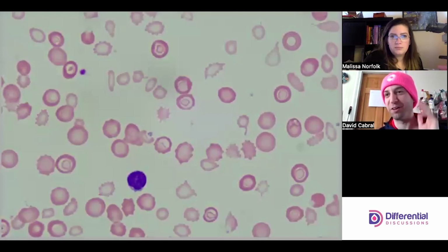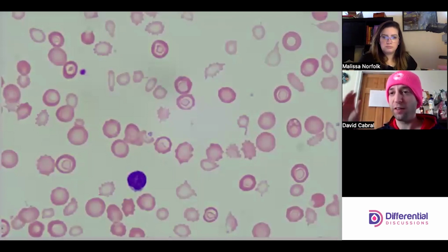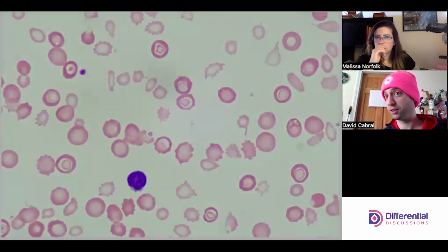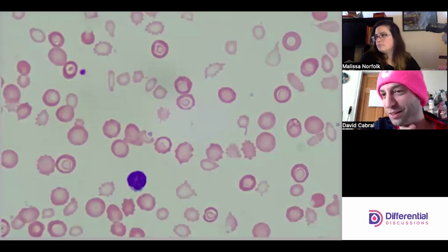Yeah, I'm glad you said that. That was exactly my thought process. I'm intrigued that there are echinocytes in both populations. Like Melissa said, echinocytes are a tricky thing. You can do everything right at the bench, and the slide still produces sections that have echinocytes. Generally speaking, though, it'll be localized. So if you look around in other areas and you see that the echinocyte populations go away, it's likely artifact. Don't report it. But otherwise, it may be an important thing to this patient's pathology. We'll have to see as we look around a little bit more.